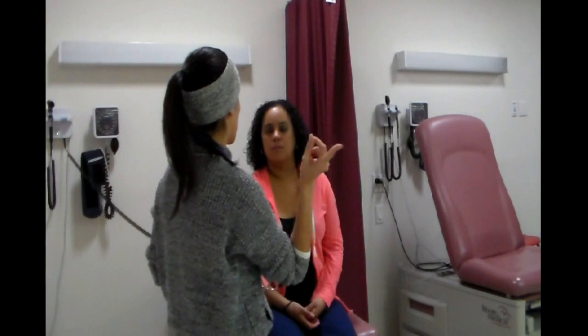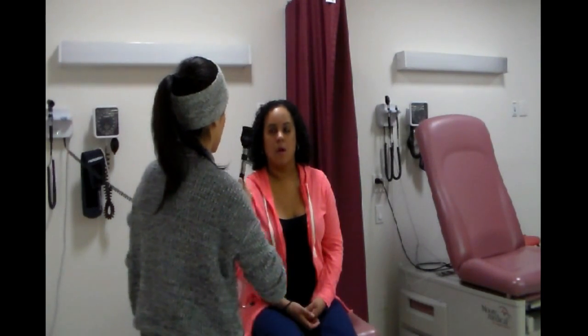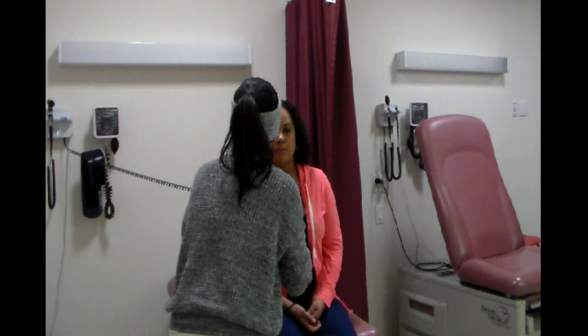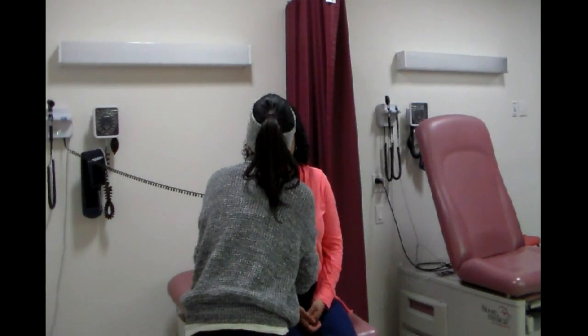Now I'm gonna look at the back of your eyes. I would turn the light off, but we can't turn the light off in this room. So I just want you to look straight, and I'm going to flash this light in your eye. I'm gonna get really close. I'm checking for red reflex, any opacities. I don't see anything.